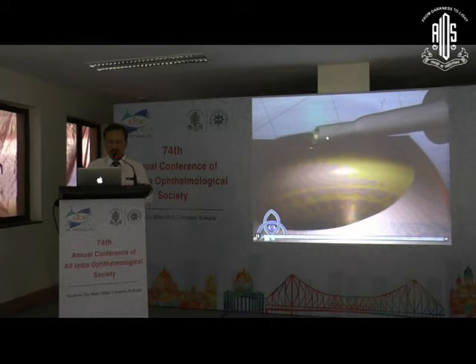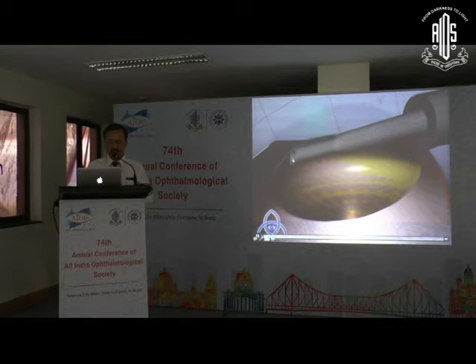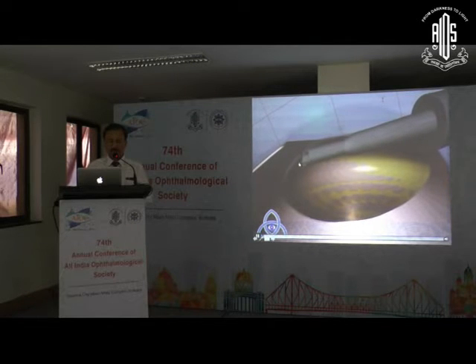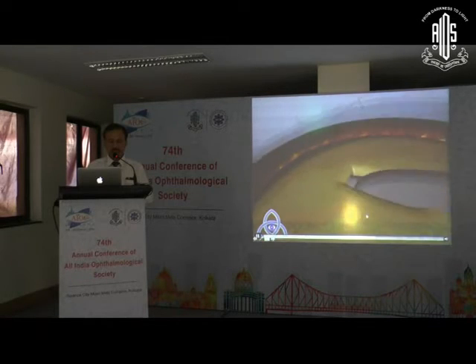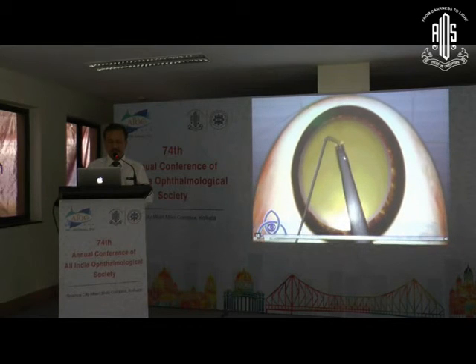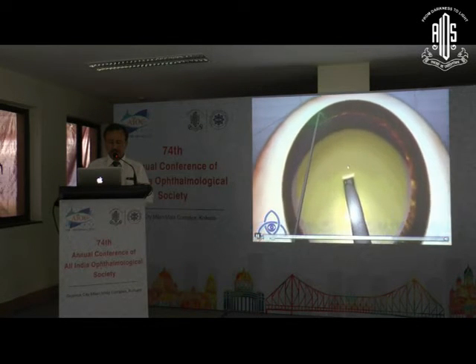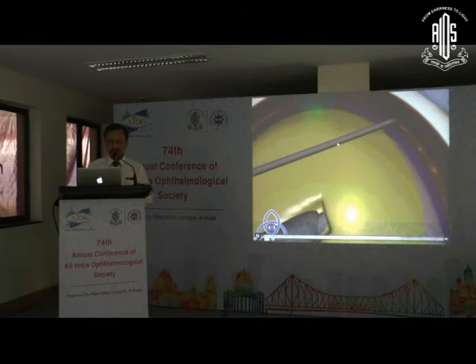Then engage the distal end of this trench with the phaco tip, and look at the movement of the phaco tip. You have to reach the equator. You don't have to go down towards the posterior plate, as we normally do in other chopping techniques. Slightly pull the nucleus and then hook the equator of the nucleus with the chopper.